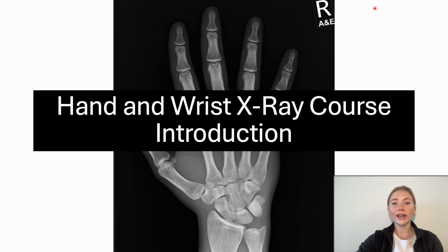The main utility of hand X-rays is in the identification of bony pathology and may be used whenever there is suspicion of bone, ligament, or joint injury, as well as with degenerative processes like arthritis and for identification of foreign objects. We will be focusing mainly on hand pathology in an acute setting, such as with trauma.